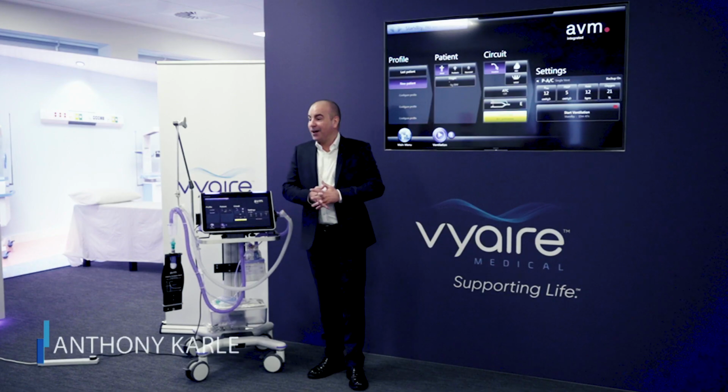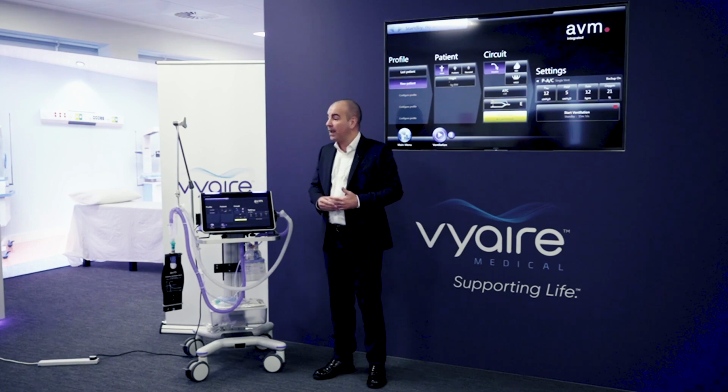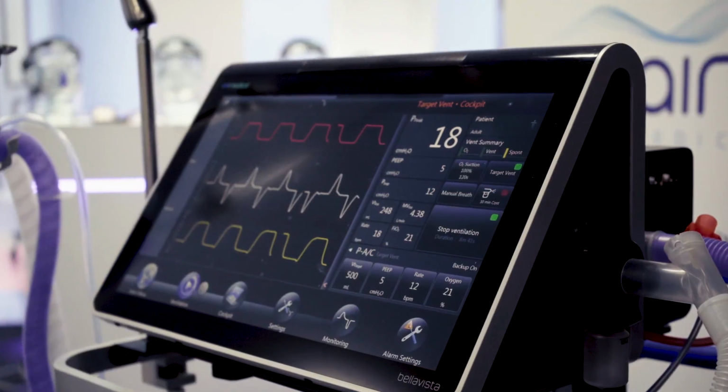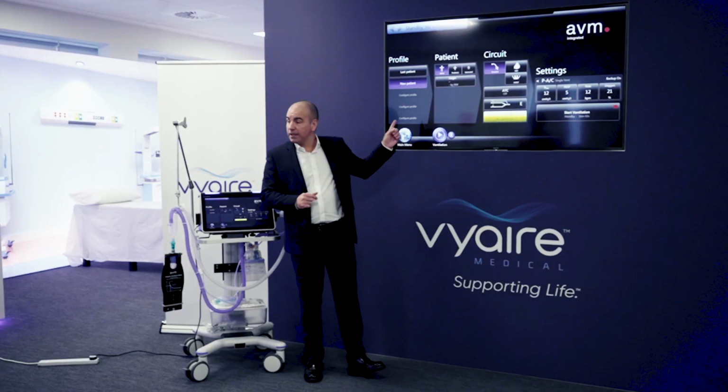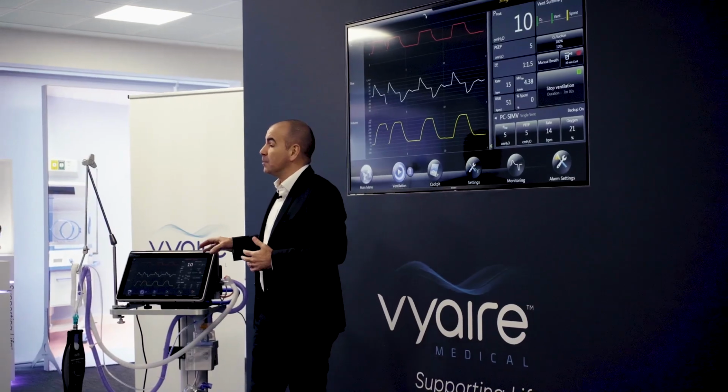Welcome. This session is going to talk about our bellavista platform that we have. Essentially, this is our conventional ventilator platform. I've connected the display up to the screen here so you have good visibility. We have several models under the platform.